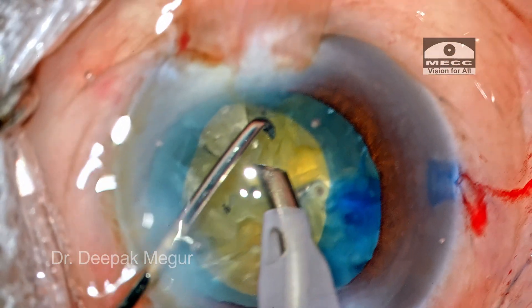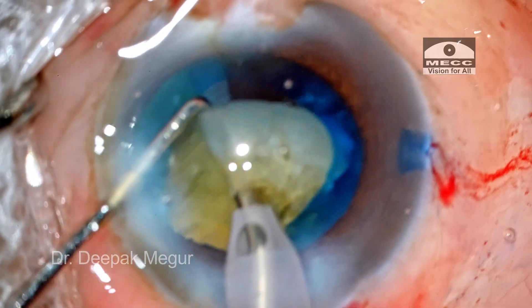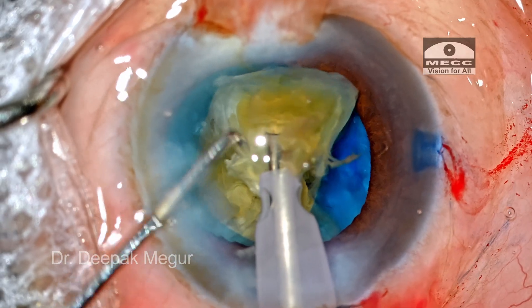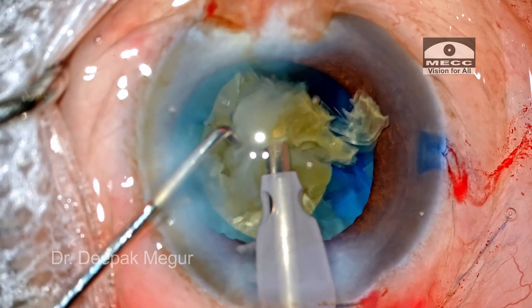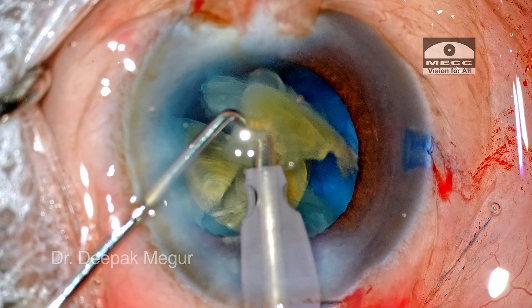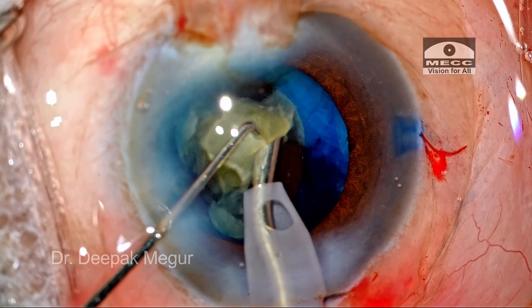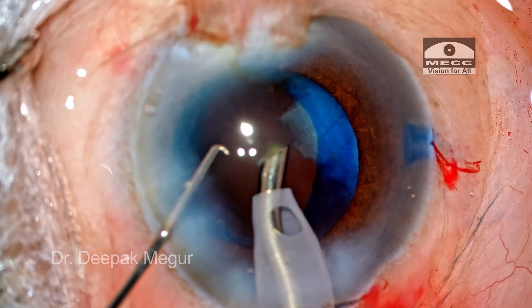There is one fragment where the posterior plate is still not completely separated from its adjacent fragment. Nevertheless, it is gently maneuvered out and then emulsified. If the attachment is not very thick, you can pull it out and during the maneuvers it gets separated on its own — that's what happened in this case. The last two fragments are emulsified and the nucleus emulsification process is done.